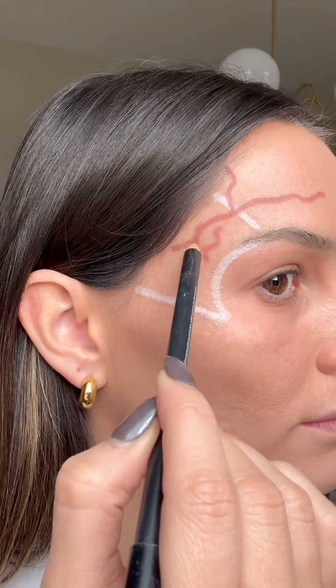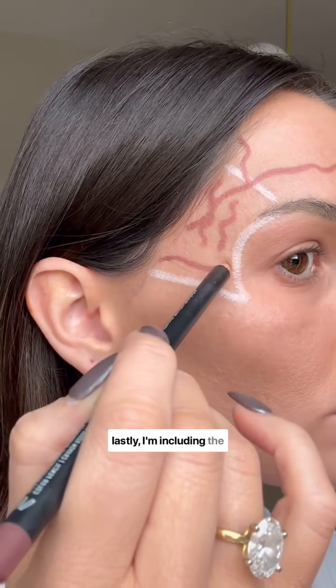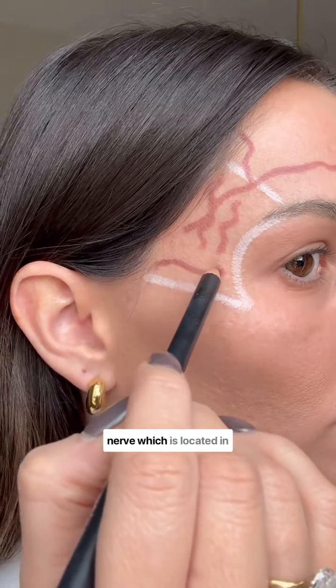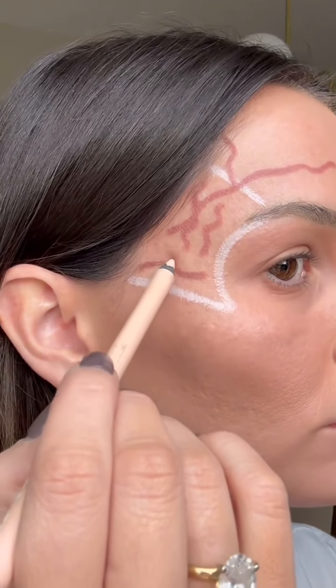Next, I'm marking out the zygomatico-orbital artery, which bifurcates from the superficial temporal artery. Lastly, I'm including the temporal branch of the facial nerve, which is located in layer 4. And now let's get to our injection techniques.